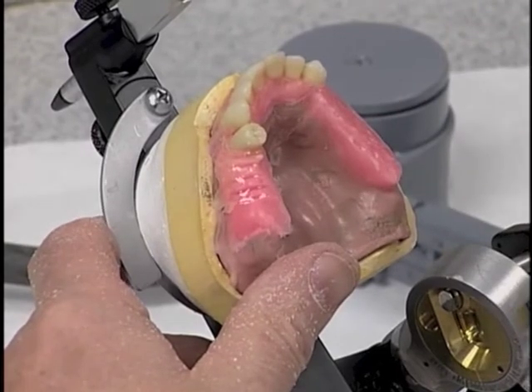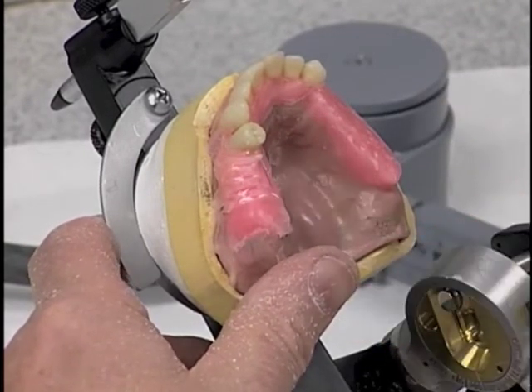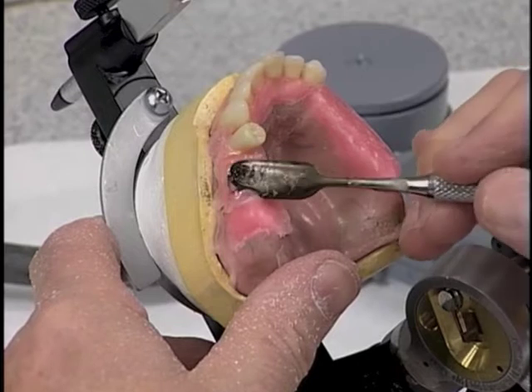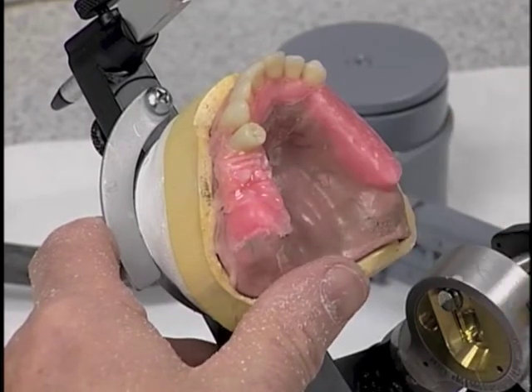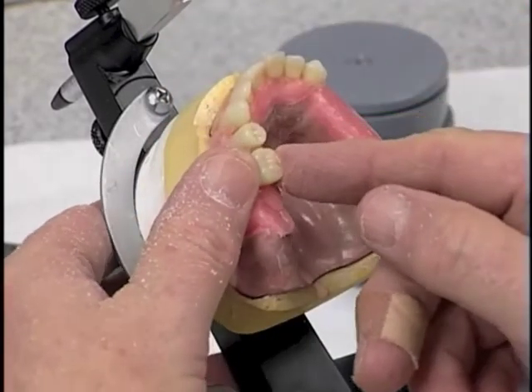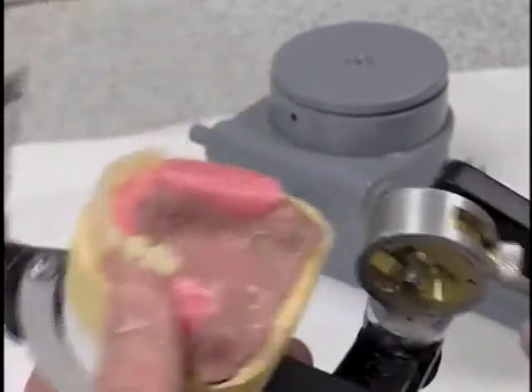So now we're going to pull the wax once again, soften the wax in the area where the first molar should be, and see if that'll go in without interference. So we take the first molar, we place that into the wax, into approximate position where we think it should be.